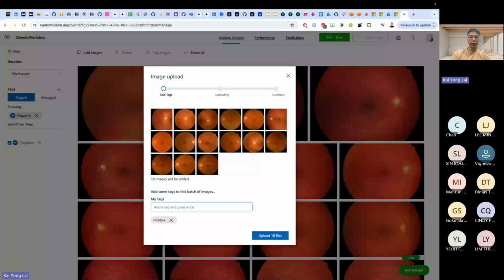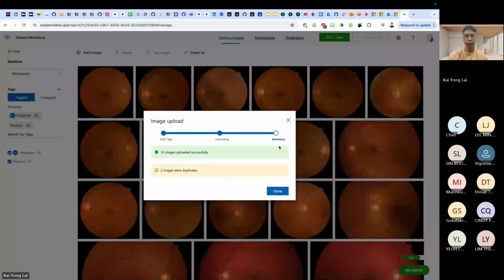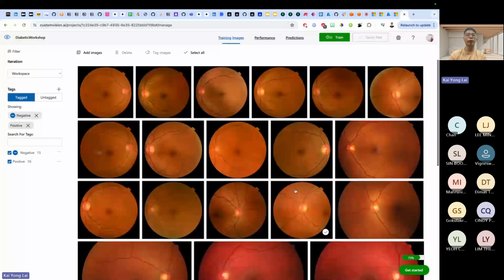Okay, so once the tag is there and my images are up, I can upload 18 images. So now you should have two classes. One is the one that is facing disease, and the negative is the one that is normal. Okay, so you can see here. And of course, if you want your models to be more accurate, what normally AI practitioners will do is feed more data to the models. And of course, there are ways of fine tuning and everything, but we won't go through that today.